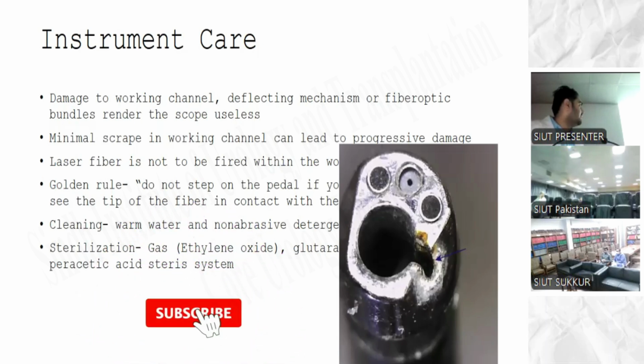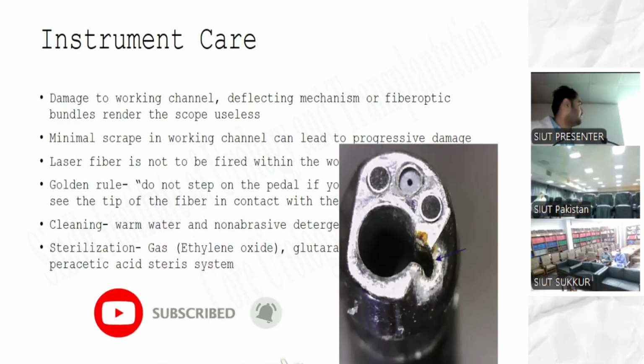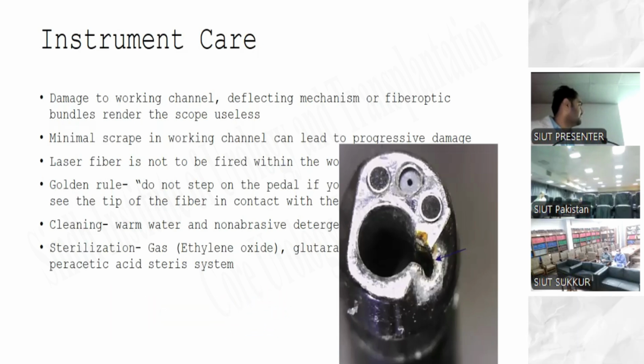We are concluding this session on the principles of endoscopy. Regarding instrument care, rather than only performing the surgery, we should also care for the instruments. Whenever we are using the laser fiber through these scopes, the golden rule is do not step on the pedal if you cannot see the tip of the fiber in contact with the stone, rather than in contact with the tip of the instrument, because if you depress the pedal then you can damage the instruments.